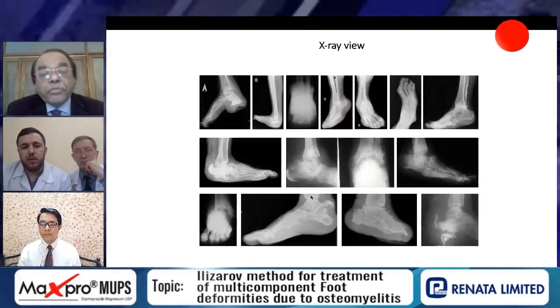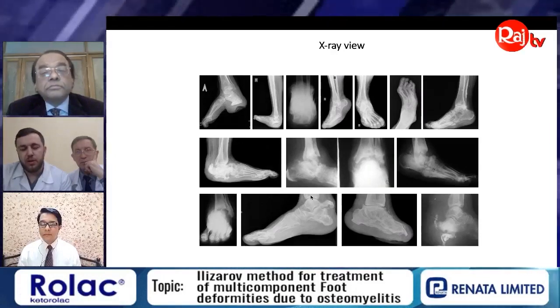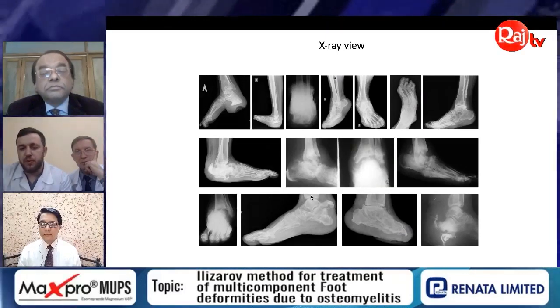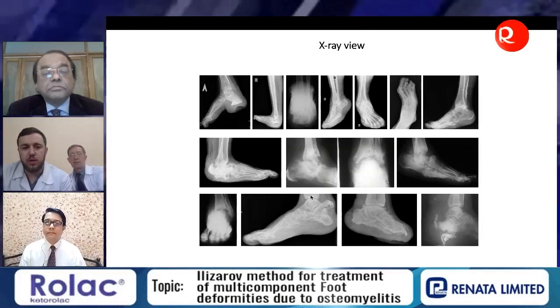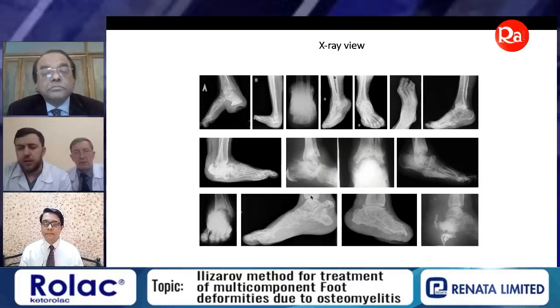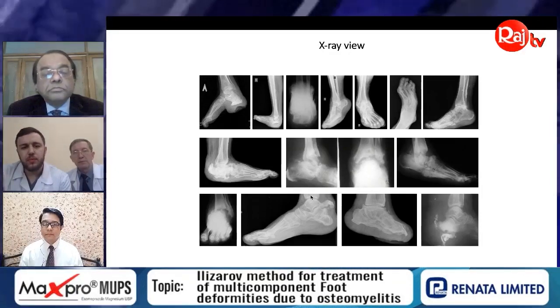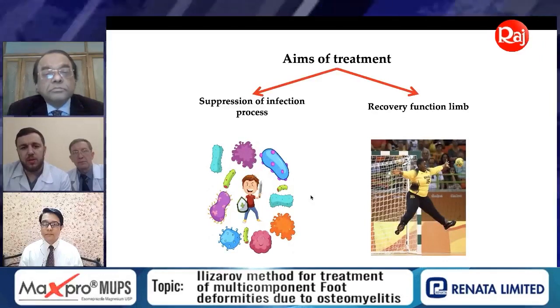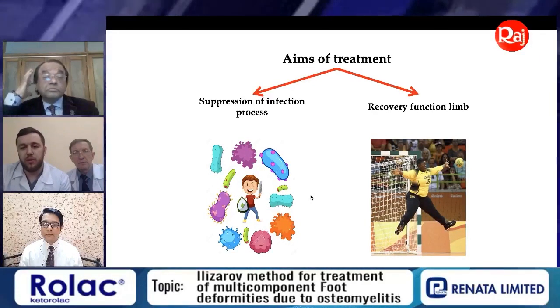So, typical X-ray view of our patients with foot infection, with osteomyelitis, and some disorders with articular surfaces of the joints of foot. So our aim is a standard suppression of infection and recovery of function of the limb.